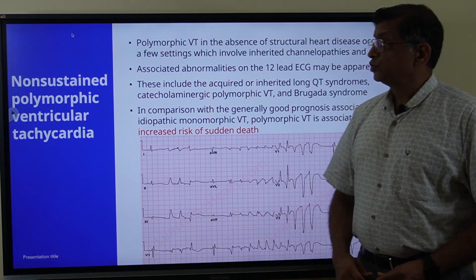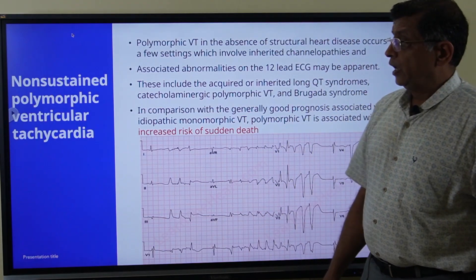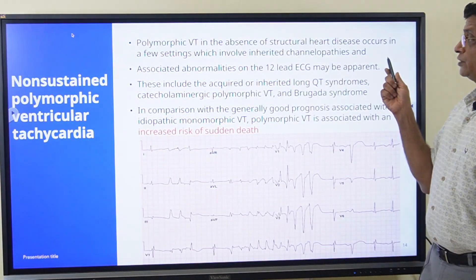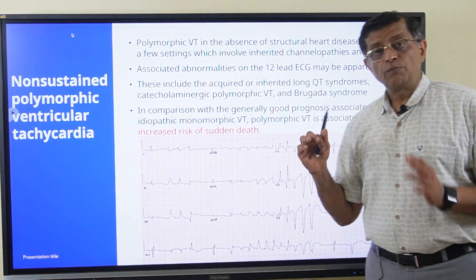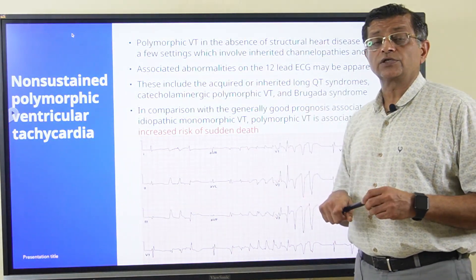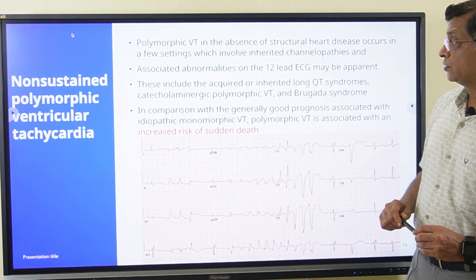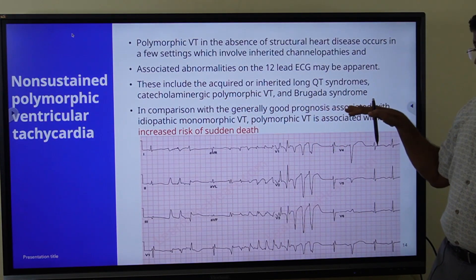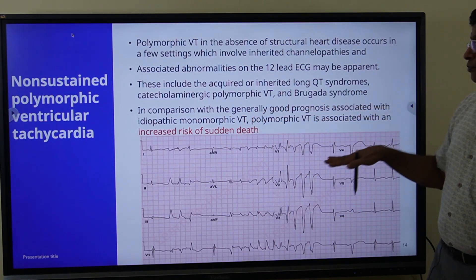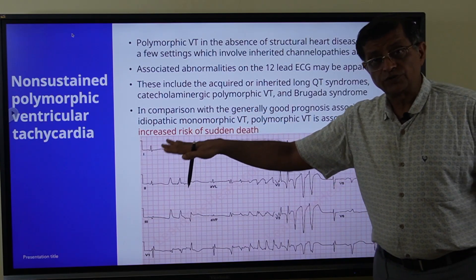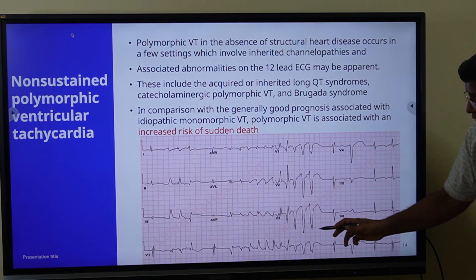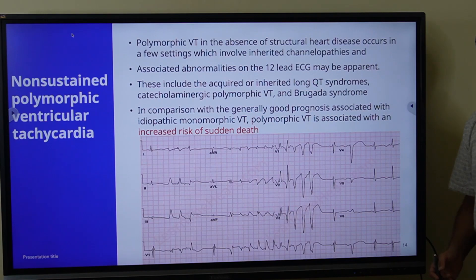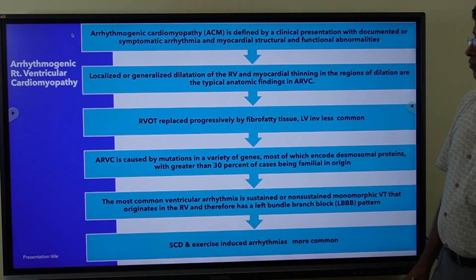The third condition is non-sustained polymorphic ventricular tachycardia. As the name suggests, polymorphic means different ventricular ectopics coming from different foci, making this more dangerous. In the absence of structural heart disease, it occurs in inherited channelopathies such as long QT syndrome, catecholaminergic polymorphic VT, or Brugada syndrome. In comparison to the generally good prognosis of idiopathic monomorphic VT, polymorphic VT is associated with increased risk of sudden cardiac death.